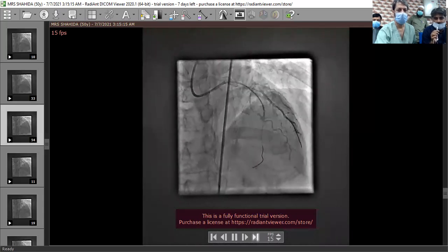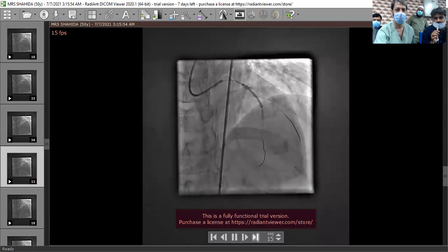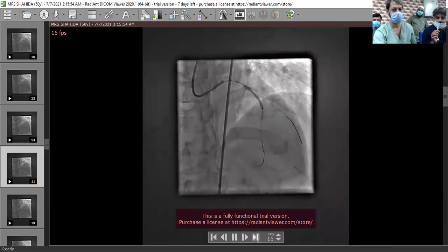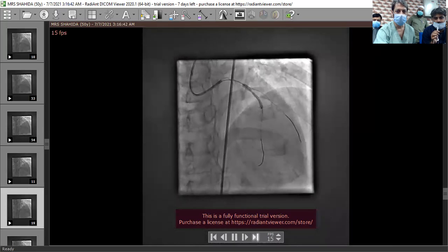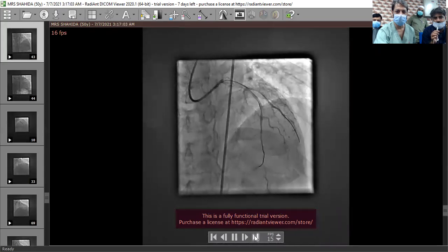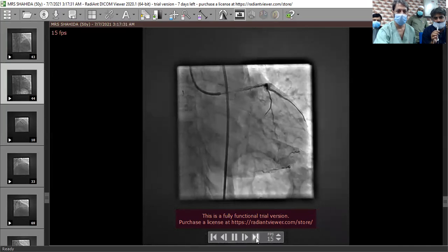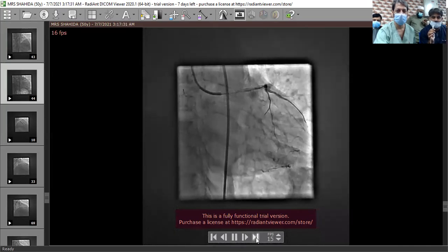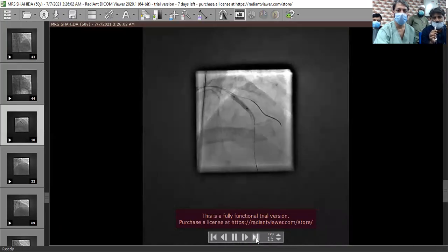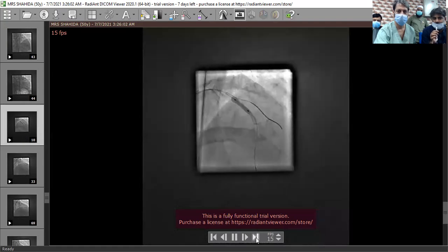The stent size is 3.0 by 25. Ballooning was done over almost the complete area. After stenting, the wire is still in the small branch. Other views were taken to further confirm any proximal or distal dissection. Then post-dilatation was performed, crossing the wires and post-dilating to 3.5 by 12.